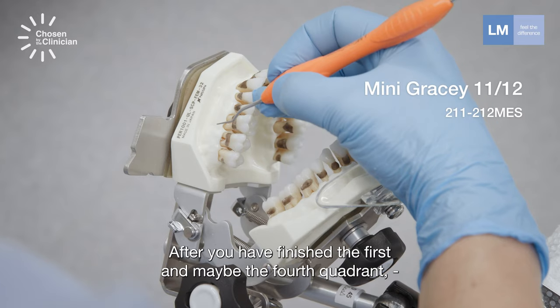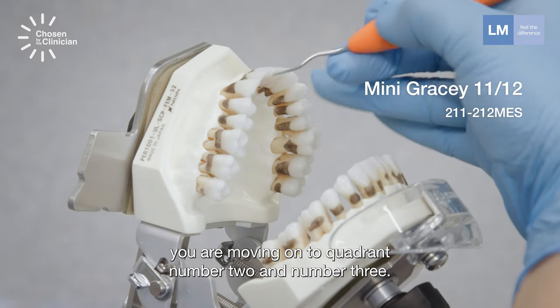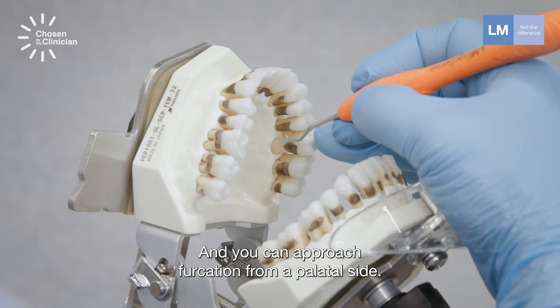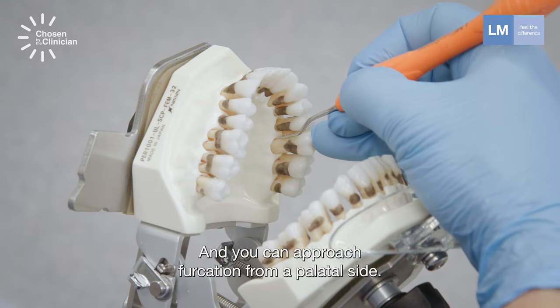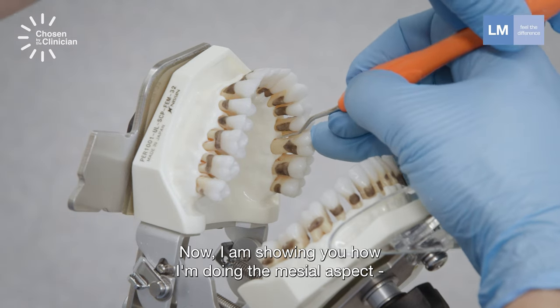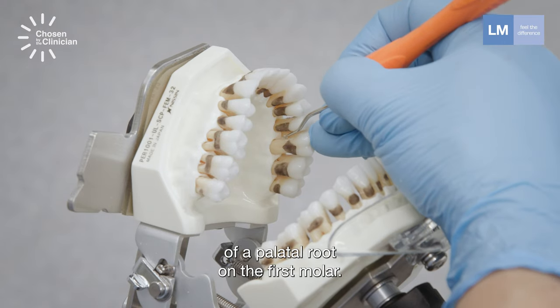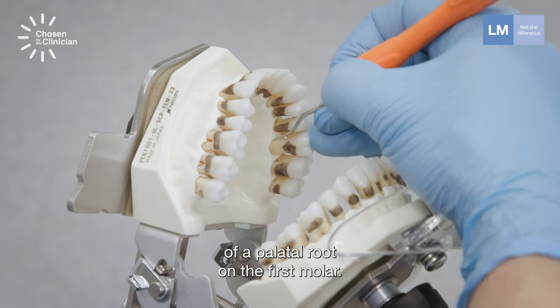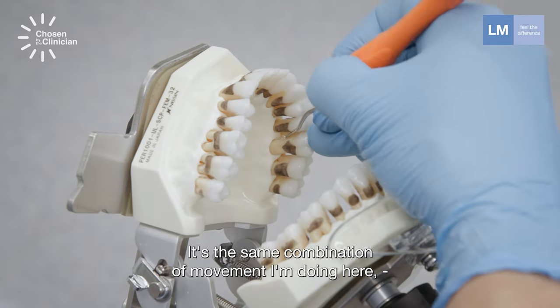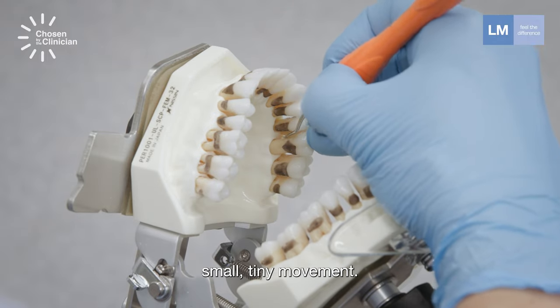After you have finished the first quadrant, you are moving on to quadrant number two and number three. You can approach furcations from the palatal side. Now I'm showing you how I'm doing the mesial aspect of a palatal root on the first molar. The same combination of movements — small, tiny movements.